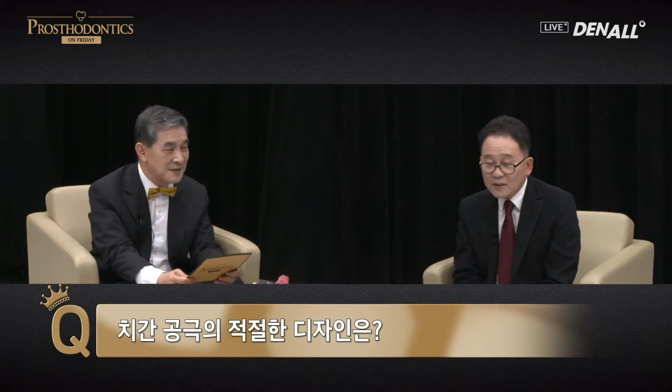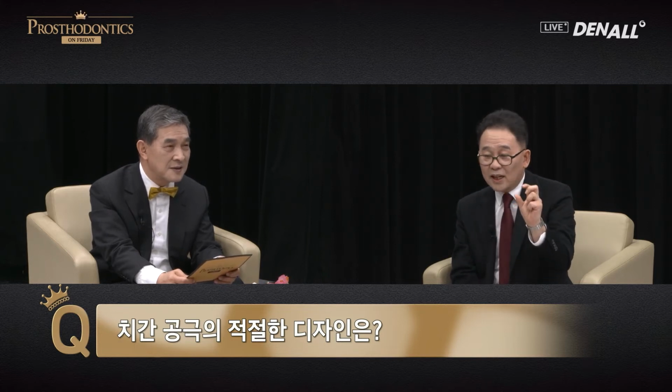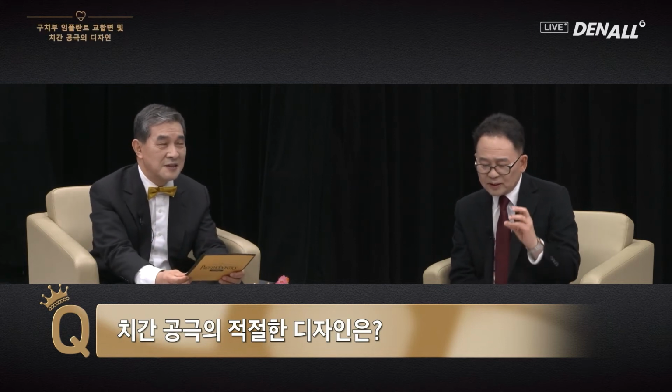This is very challenging. I'm a prosthodontist who considers function very important. Embrasure space should be made big for easy cleaning and for the use of an interdental brush. Do we need to focus on function or aesthetics in creating the embrasure space? It also depends on what the patient wants. Yes, do we need to consider what the patient wants for aesthetics?